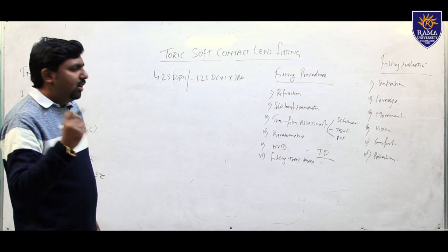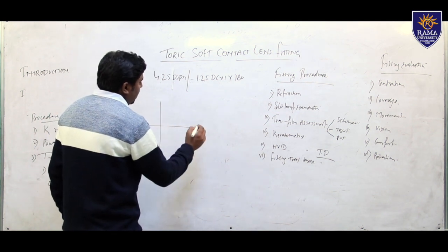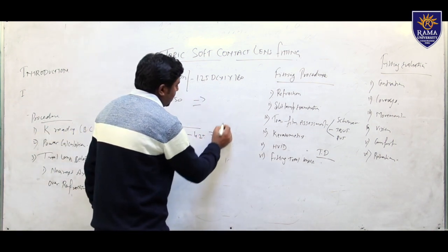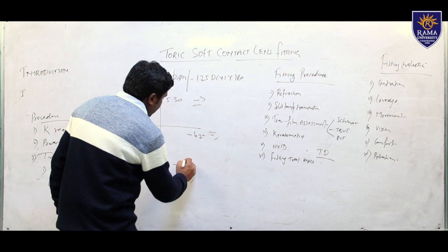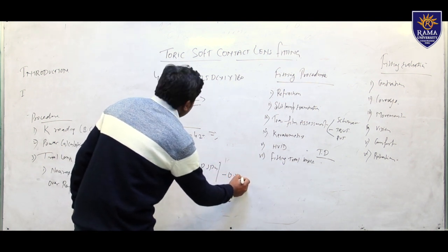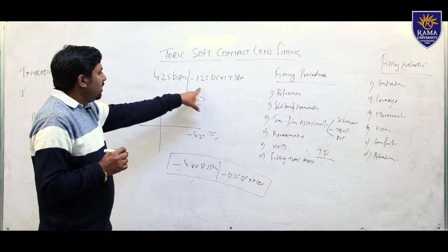For calculation of the power, we have to bifurcate in this cross and write down the power like this: 5.50. We have to do the vertex distance calculation in both powers. So approximately we get the power of -4 diopter spherical and approximately 0.75 diopter cylindrical, axis approximately 180 degrees. So this is the power for the contact lenses and this is the power for the spectacle.